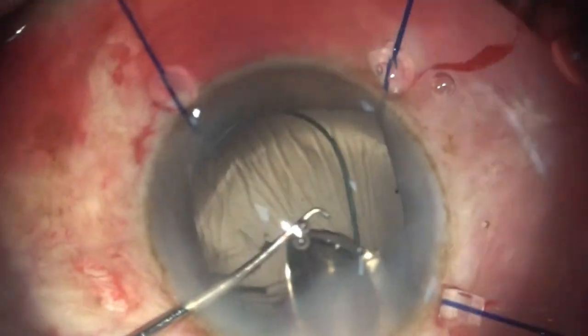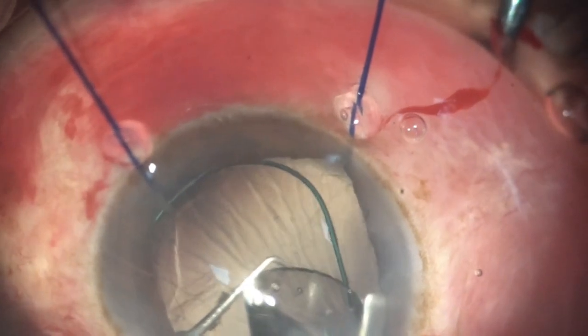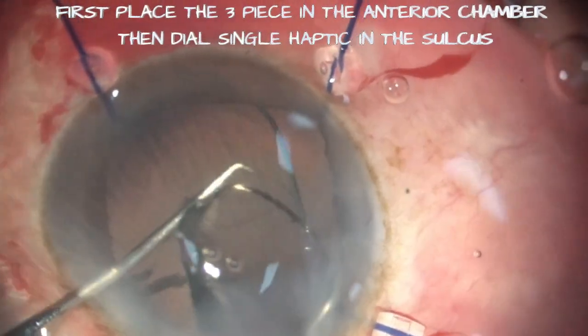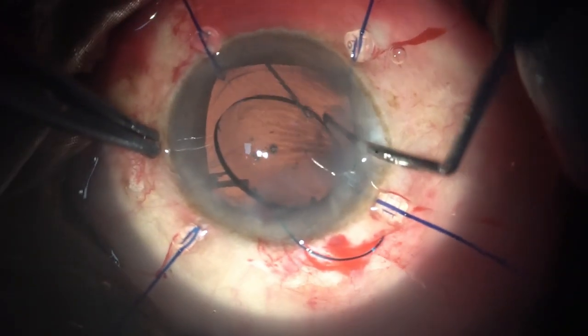Anterior vitrectomy was done, and now is the time to inject 3-piece IOL in the sulcus. First, the 3-piece IOL is to be injected into the anterior chamber.